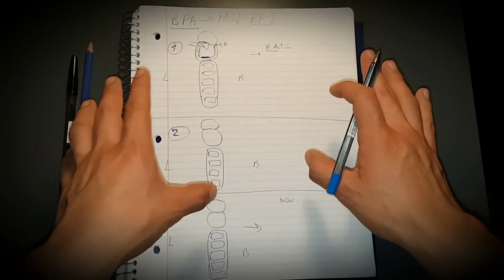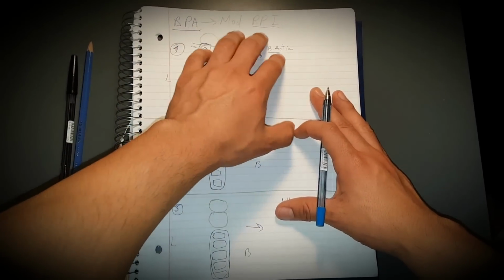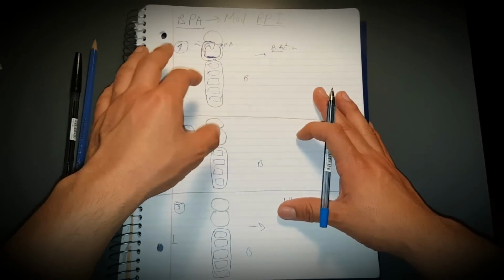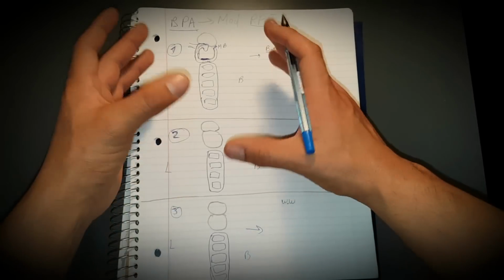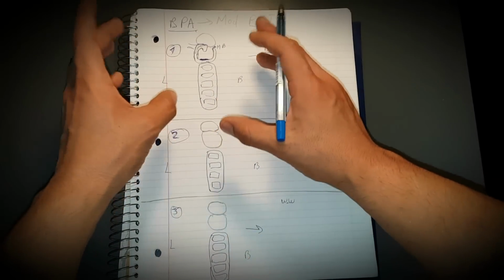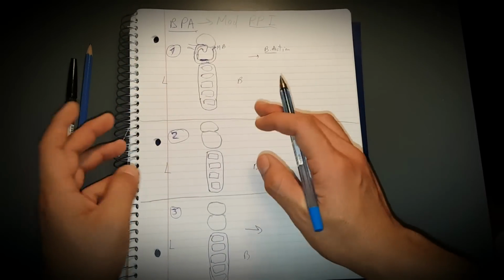It has 3 variations. First, it was created as a modification of an RPI clasp, which we already saw. So I'm going to draw 3 different cases, the 3 scenarios. And imagine this is just premolars. This is a saddle, premolar, saddle, buccal, lingual, buccal, lingual.